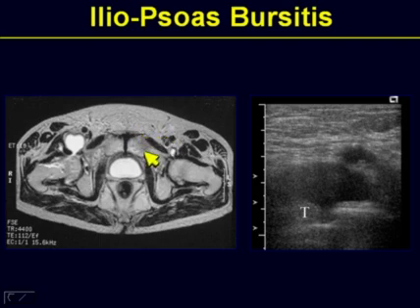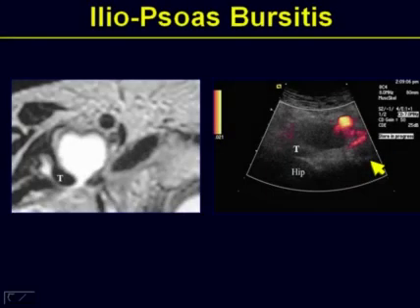Looking at the right hip on ultrasound on short axis view, you can readily identify the bone acoustic landmark of the acetabulum and femoral head, but also the fibrillar pattern of the tendon. And then once you have identified that, there is a collection of hypoechogenicity in between the tendon and a second area of hypoechoic structures. Clearly, if you've done that, then remember that it was going to be tendon, bursa, and vessels.